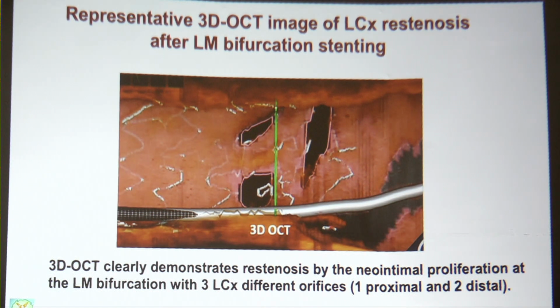It is the problem. If you select the proximal site, this area goes up to the main vessel of the LAD. At that time, you may have another problem. And if you try to do the kissing balloon, we do not have any good results to speculate, but still there are metal carina there.